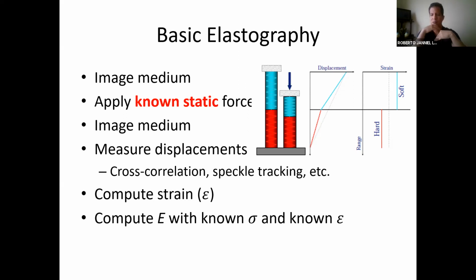In practice, the sonographer has a transducer and starts applying a very slow, controlled force, basically compressing with the transducer itself. That's how these things actually worked in the very early days of elastography, mind you.